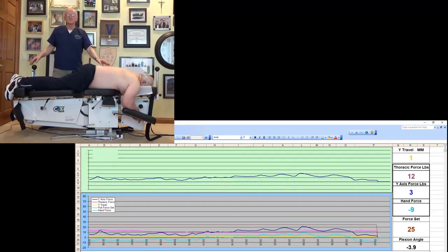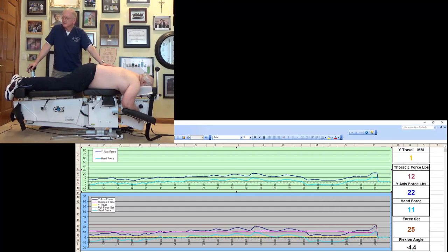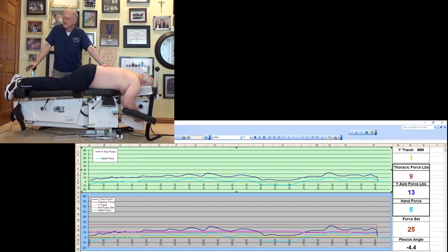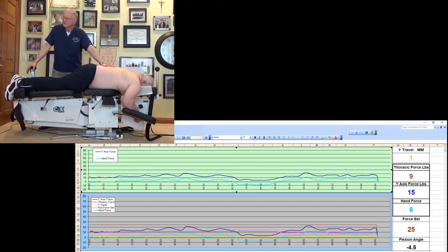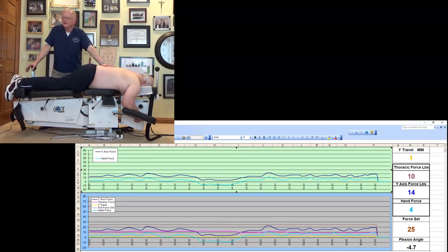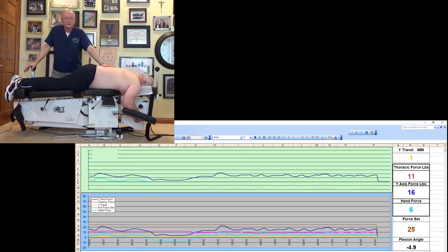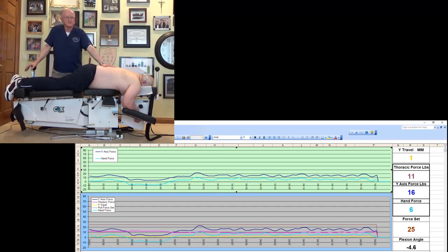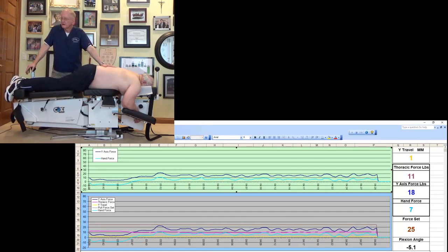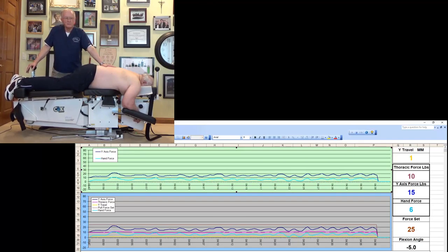Now I apply distraction of two pounds. And watch the graph change. You see how it's a small graph. I'm going there from 15 to 17 pounds. I'm going two pounds. You see the graph. The light blue line is my pressure on the spinous. The dark blue line is the application of the distraction force. And if I go a little more, I'm going to go to say four pounds. Please observe the height of the sine wave. Now I go four pounds. And you see that the sine wave increases, showing that I'm now applying four pounds. Doctor, for me, this force will handle my patients.